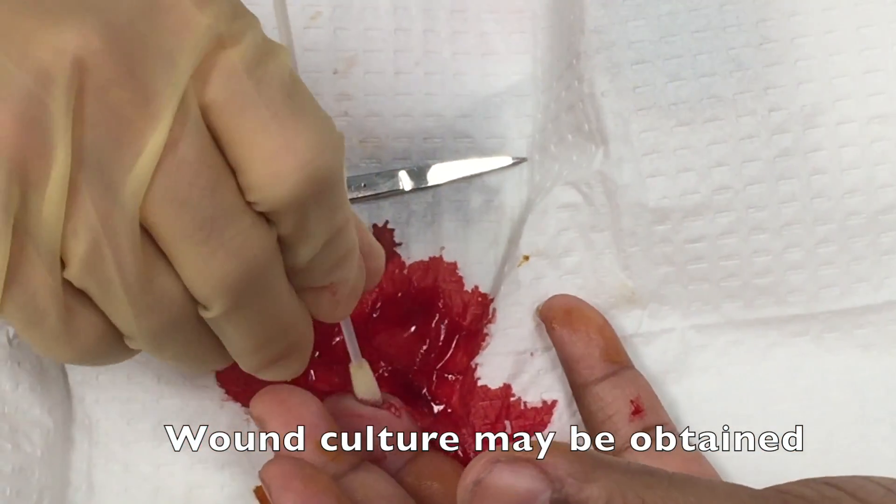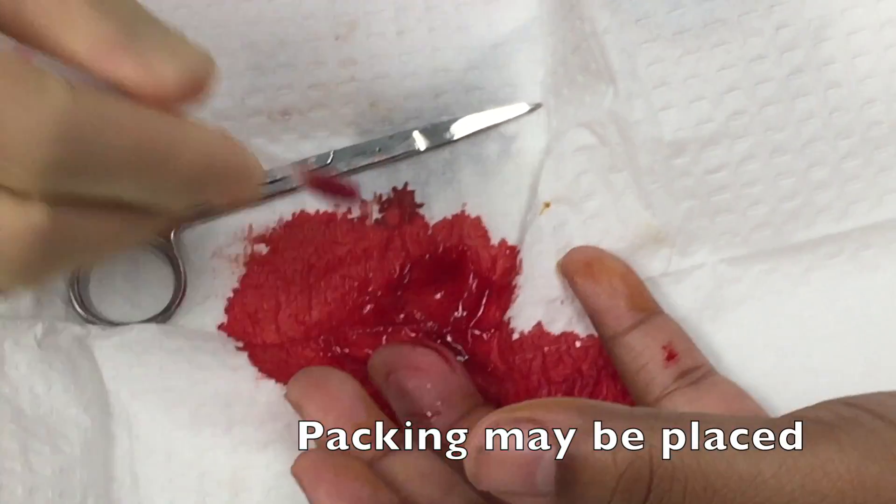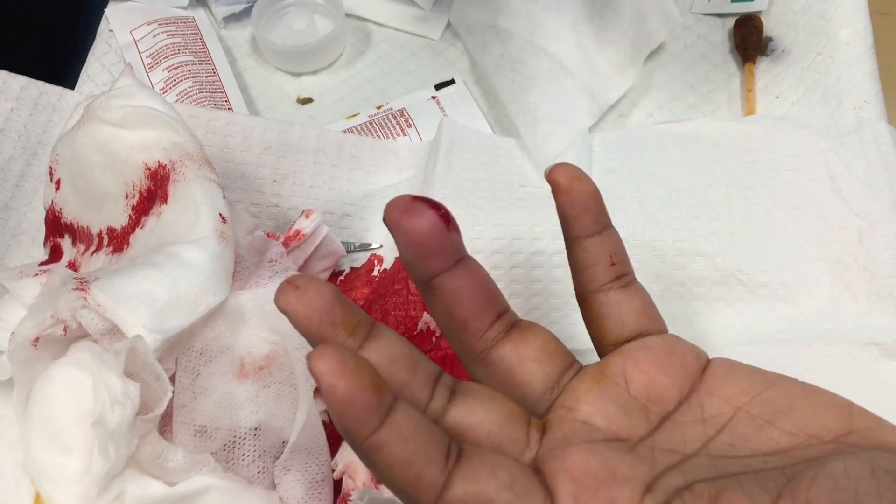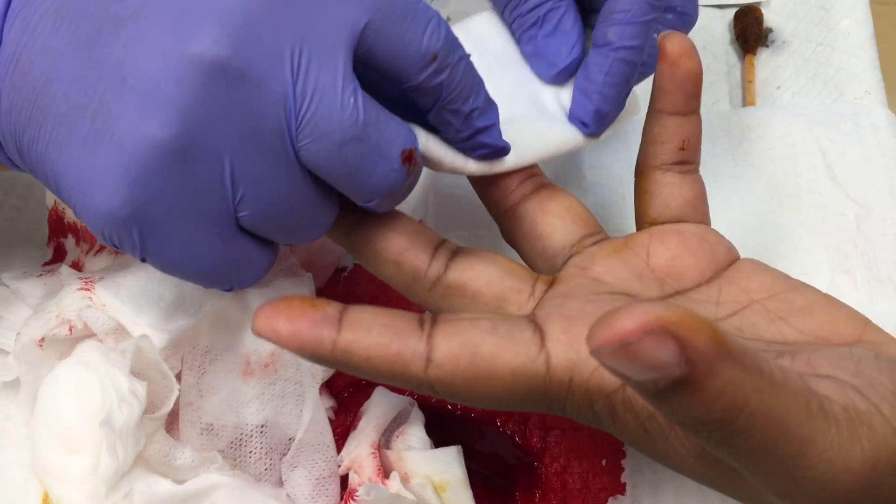This is an appropriate moment to obtain a wound culture if you feel it's necessary. You can also place a wick of iodoform or plain gauze packing in order to stent open the wound.